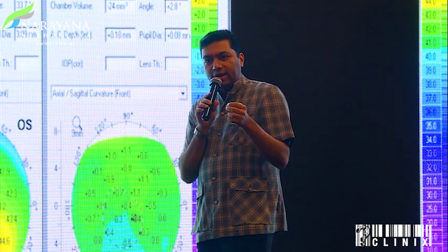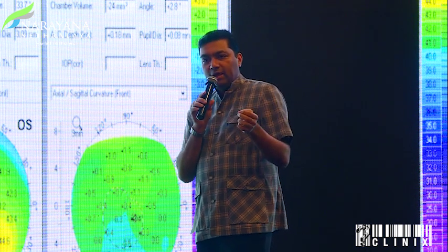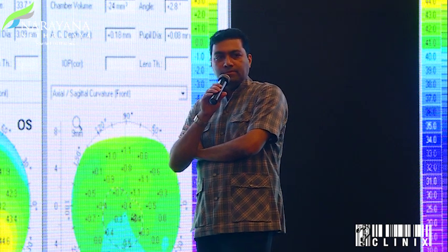That means if you don't have flattening, you mean that it's not working. No, I'm ready to give my talk this afternoon about those criteria, but flattening is a nice side effect that has nothing to do with a real cross-link. You use the word nice side effect. Is it really nice? It could be nice, and I will show you some cases where it's really bad.